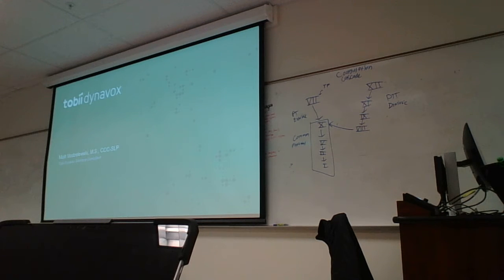My position within Tobii Dynavox is a solutions consultant. So what I do is, if there's an SLP or family member that reaches out, we coordinate a meeting where I'm able to bring the devices out. So it's either to the home, to hospital settings, to clinics, and then we're able to start the process of getting evaluated for a communication device.